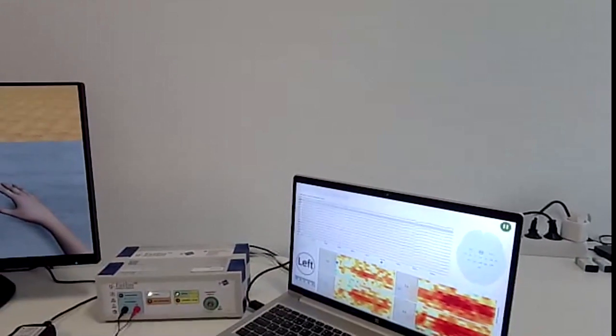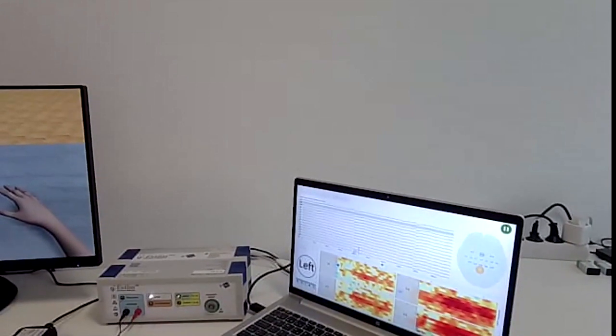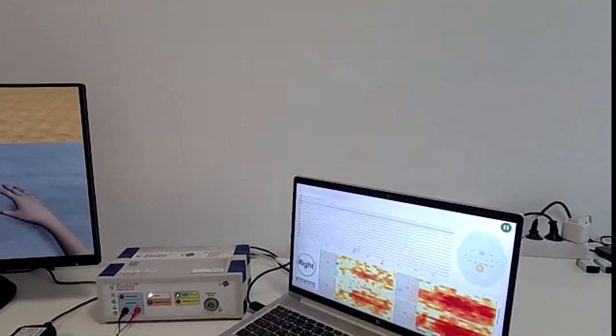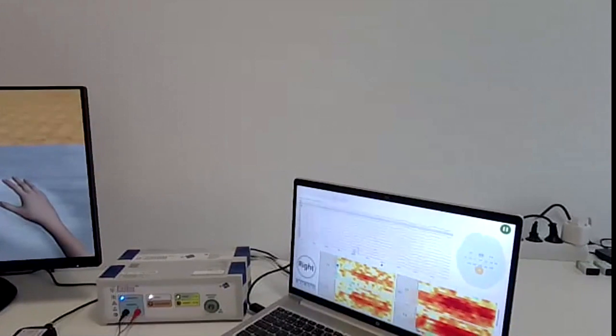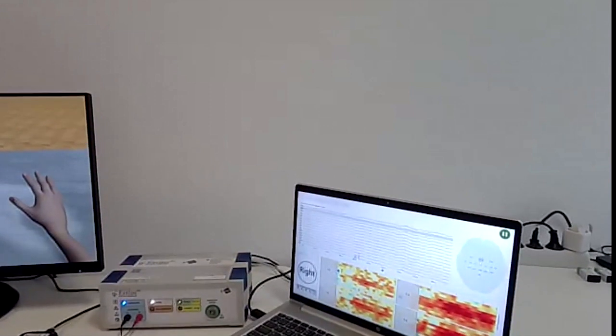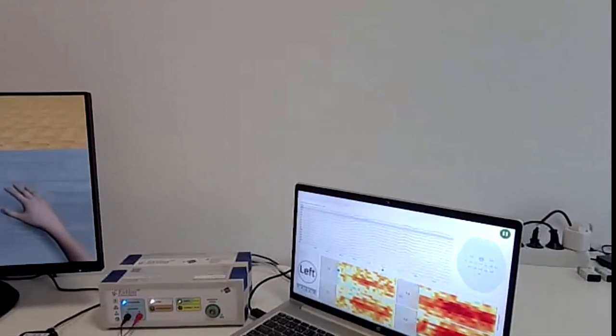That's why I say that during the session, the therapist should be really silent next to the patient, looking at the screen, checking that the quality of the signal is okay, but not disturbing the patient, not talking and not moving around. Just the opposite of what I'm doing now.